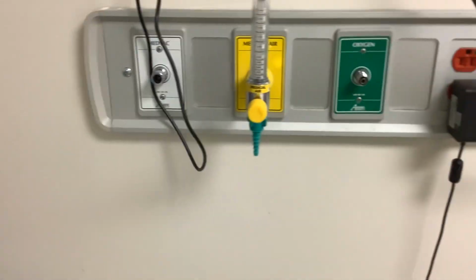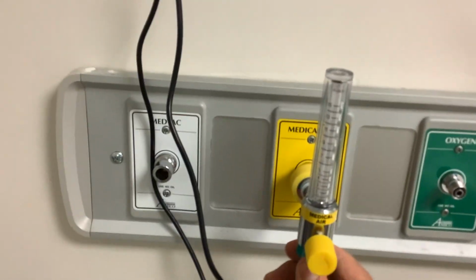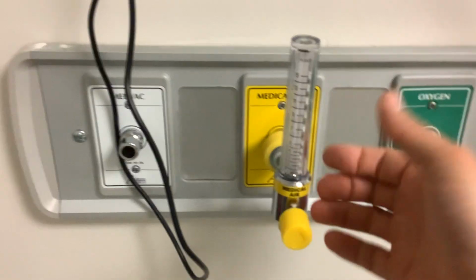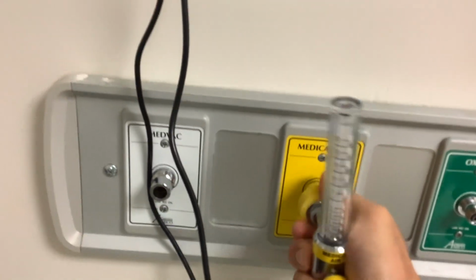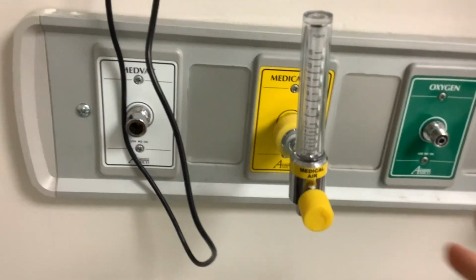It's a little bit easier for me to get to the air flow meter, so I'll utilize this one. And I'm going to take this barbed adapter or the Christmas tree adapter off. This will make it easier for you attaching your oxygen tubing to those items. It is important for you to be able to practice taking these on and off the wall. So left to loosen, right to tighten. And you may need to put a little bit of inward pressure on that as you're placing it into the wall.